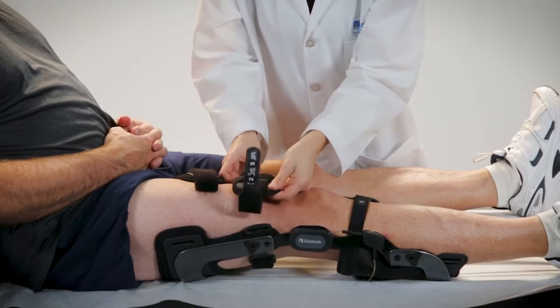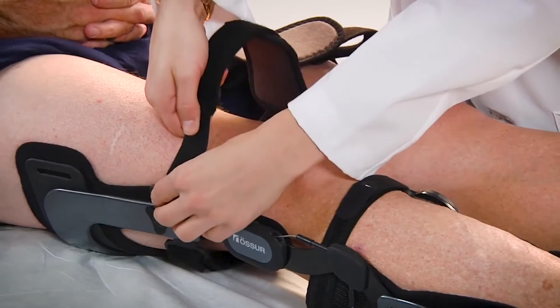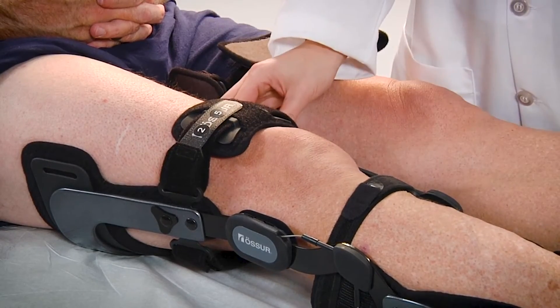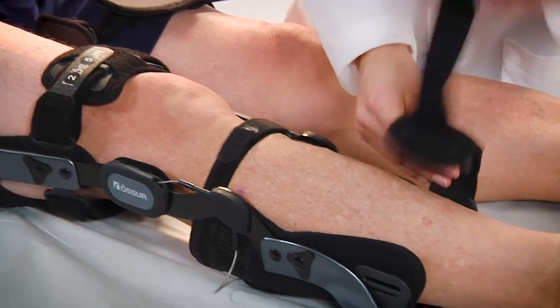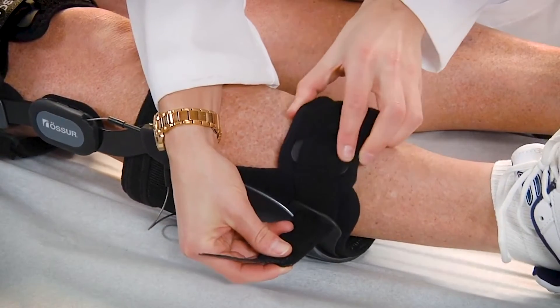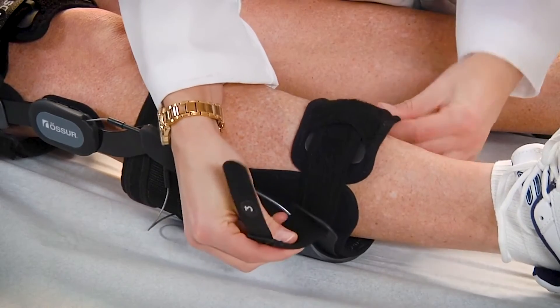Then stabilize the device by loosely attaching the lower thigh strap. Next, snugly fasten the shin strap by inserting it through the slot in the calf subshell while centering the shin pad on the shin.